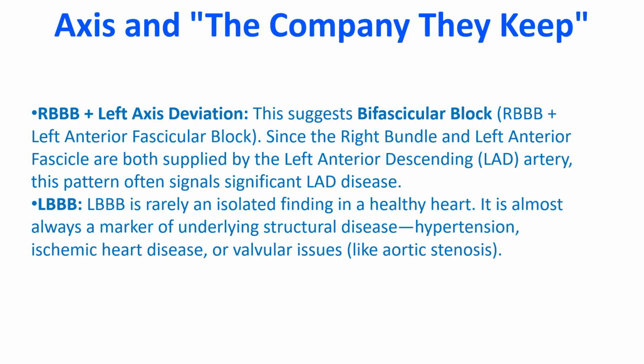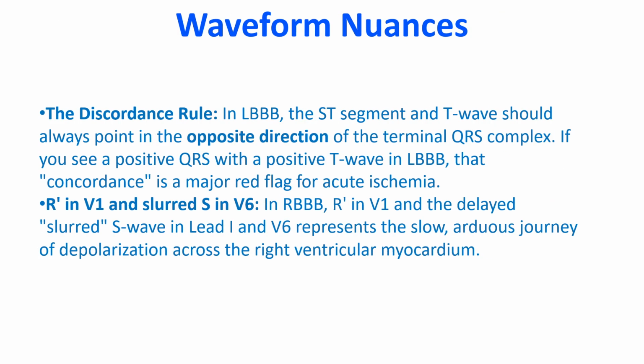LBBB is rarely an isolated finding in a healthy heart. It is almost always a marker of underlying structural disease like hypertension, ischemic heart disease, or valvular heart disease like aortic stenosis. The discordance rule.